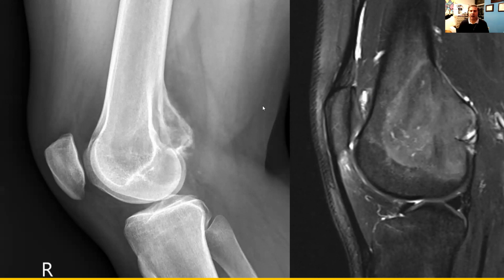So the differential diagnosis radiographically was concerning for well-differentiated intramedullary low-grade central osteosarcoma, given its large appearance but somewhat indolent growth, and the specimen was subsequently resected.